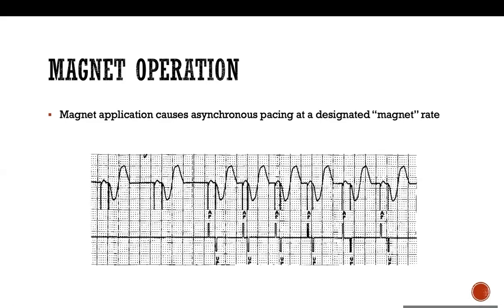So if someone is going to surgery and they're calling you because this patient has a pacemaker and does it need adjustment before going to surgery? What information do you want and what information are you going to tell the operating team?